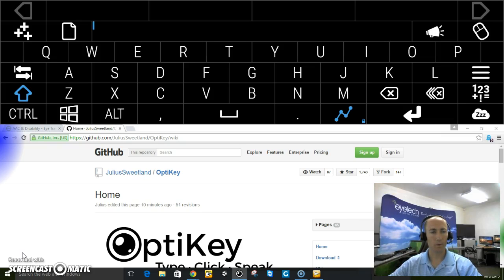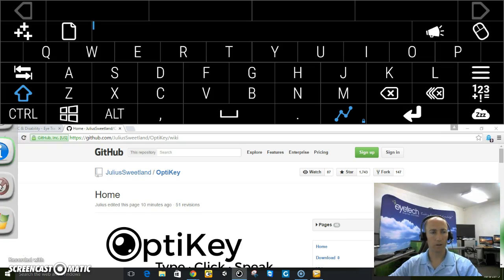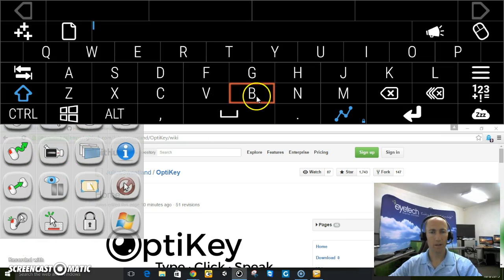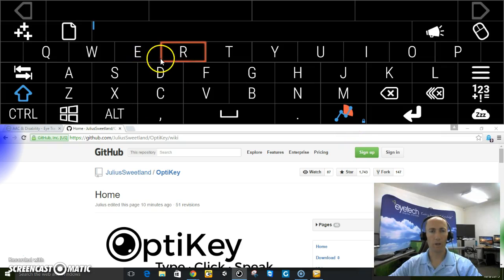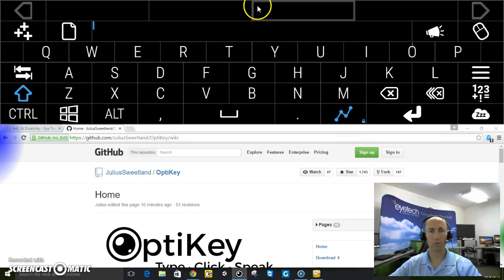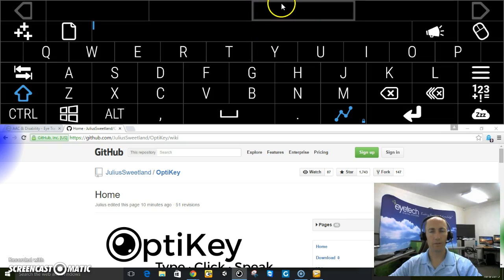I'll go ahead and unpause eye tracking. Just look over the blue hot spot here on the left. And one of my favorite features is called this MultiKey Selection. It allows you to type words, long words, really fast and efficiently.